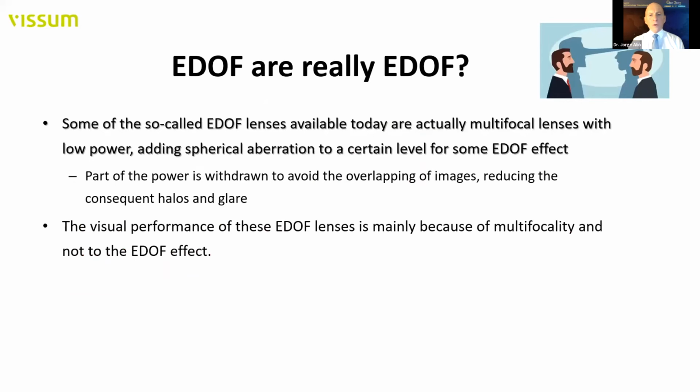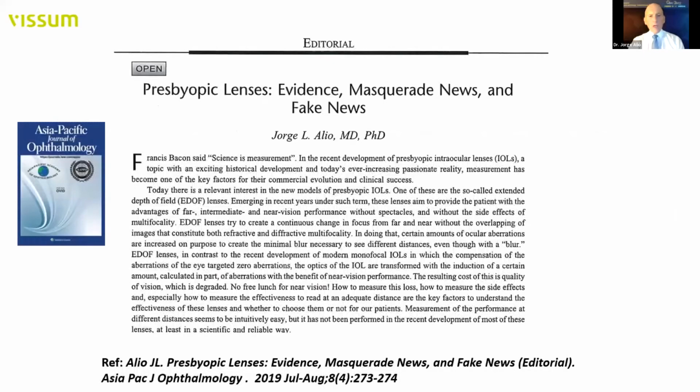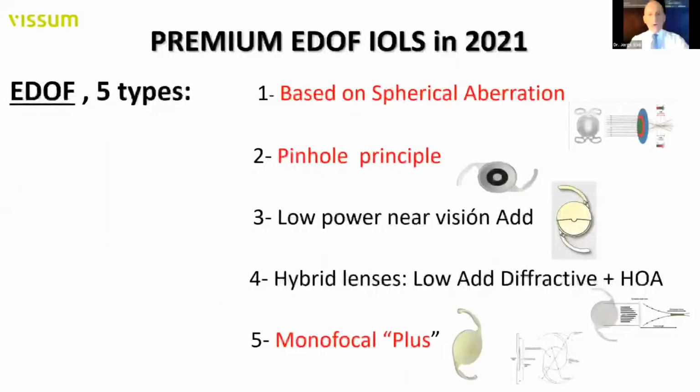You have to be aware that not all the EDOF lenses are really EDOF. Many of them are multifocals with low add power that should not be called EDOF in pure concept. This is an editorial that I published in the Asia Pacific Journal of Ophthalmology, in which I was defending which was the true EDOF and which is masquerade EDOF, which indeed should not be considered as that.